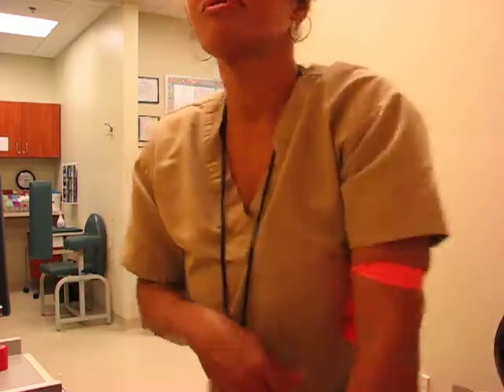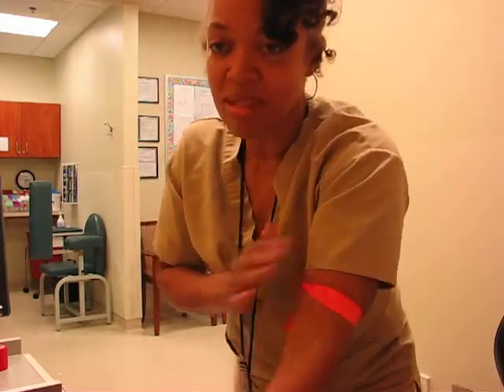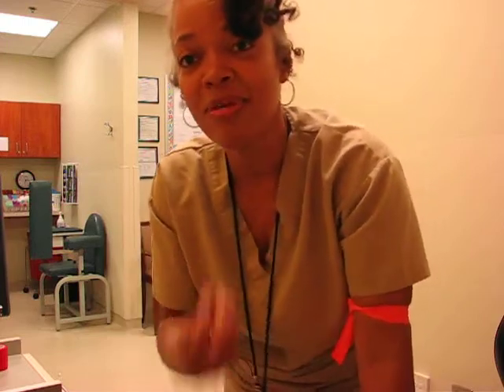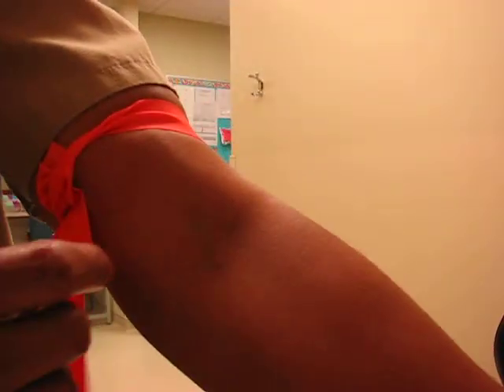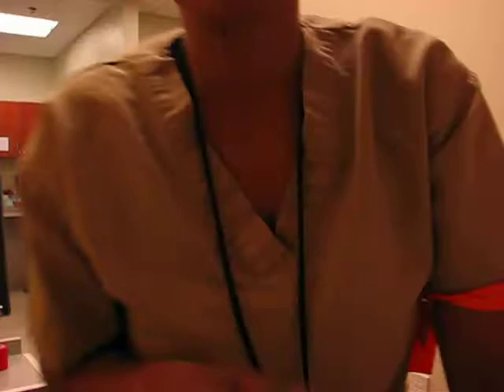You have to put the tourniquet on the patient's arm. If they're bedside, of course they relax in the bed — sometimes you can have the arm fall off the bed, because gravity. Think — gravity will help you find the veins you think are not there. In my case they pop right up, right? And this is what you want. You want people like this all the time, but you're not always going to get that.